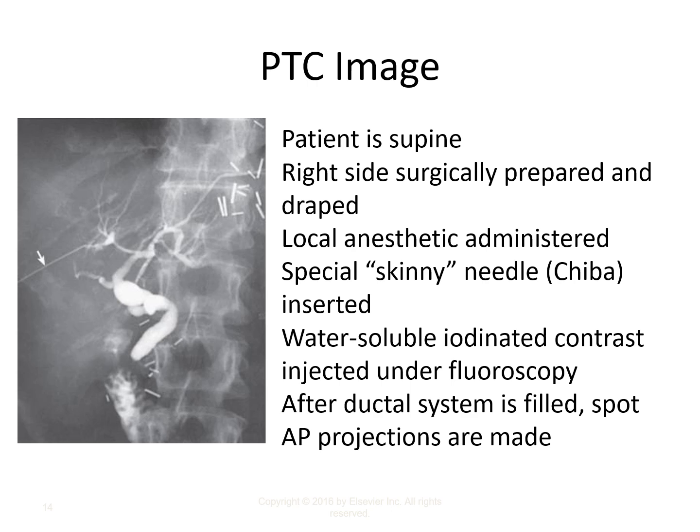So it's possible that with the abundance of staples here, they could have had a Roux-en-Y or a gastric resectioning or perhaps some kind of small bowel or GI tract surgery where they removed a loop of bowel previously with all these staples.